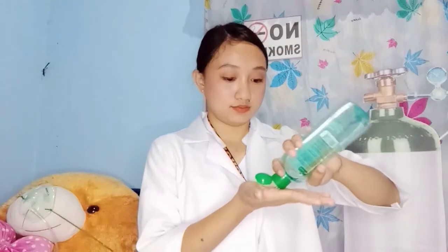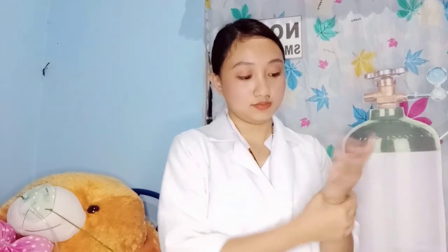Next, remove PPE if used and perform hand hygiene. And lastly, document.